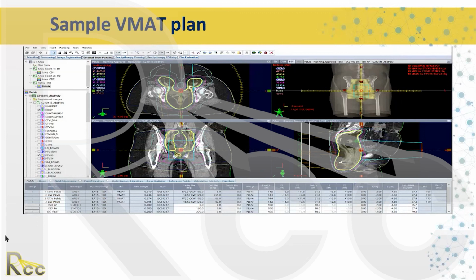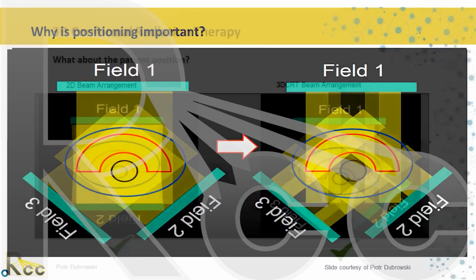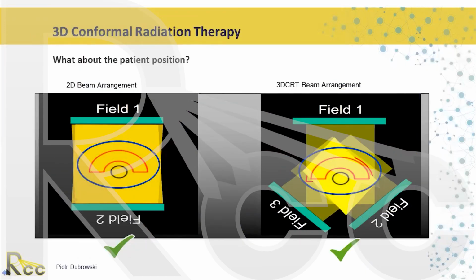I wish I had a video to show you, but you'll see that these are always moving when you do IMRT. So you don't get a solid field versus, let me show you that breast plan.